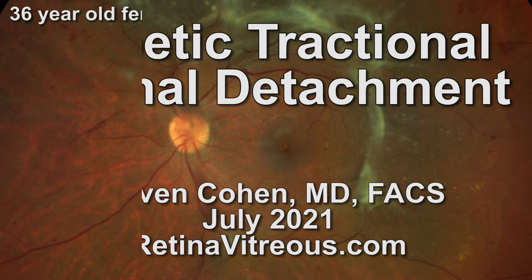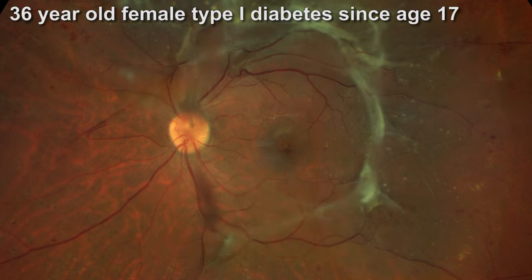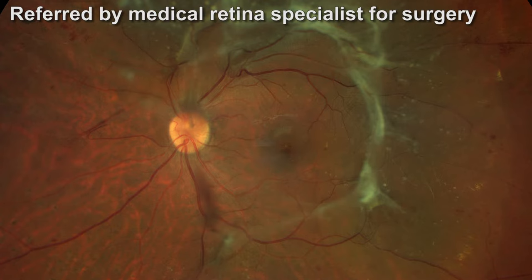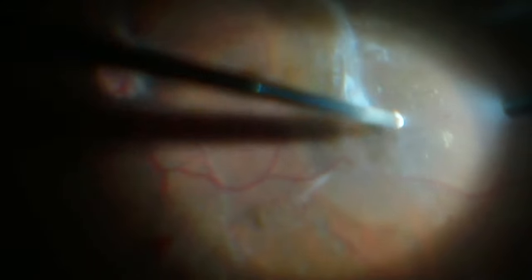This is Dr. Stephen Cohen and this video shows surgery for a diabetic tractional retinal detachment. I've outlined the detachment here in blue. You can see that it's very close to the center of the macula. This patient was referred in by a medical retina specialist who felt it was time for surgery, and I definitely agree. You can see on the OCT scan how close the detachment is to the center of the retina.